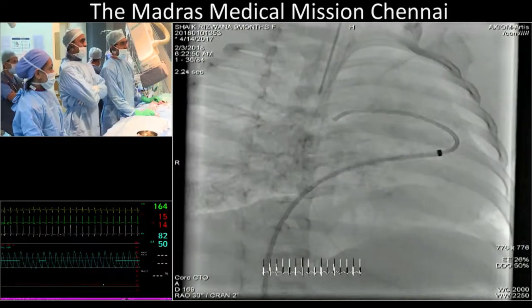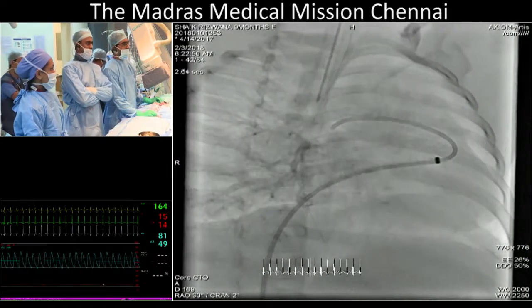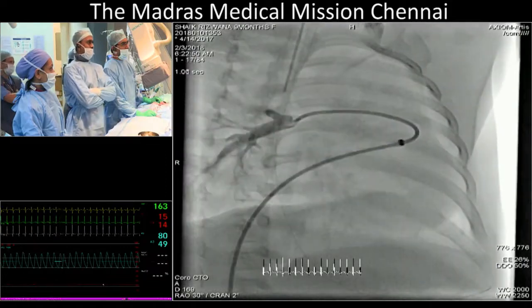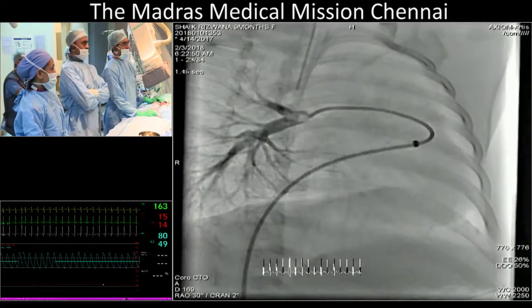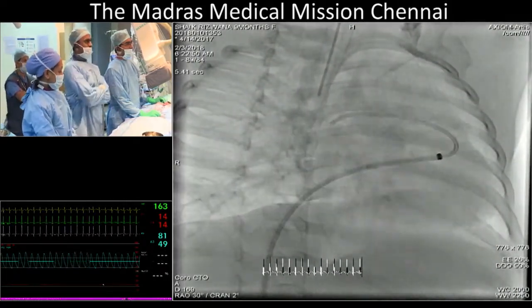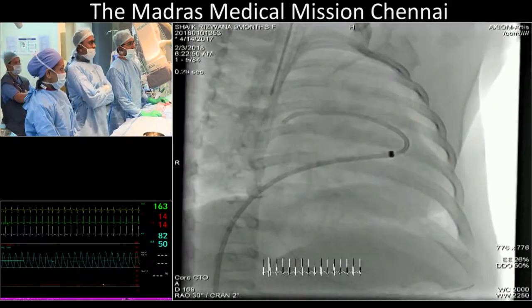We are checking for the peripheral pulmonary artery arborization because some of these patients may have a very distal PA stenosis, and then we may not get a great result following the ballooning of the proximal mediastinal PA. So this is a check of the post-hilar pulmonary arteries, which are good. The levo phase shows reasonably wide open supravalvar aorta. Next picture.